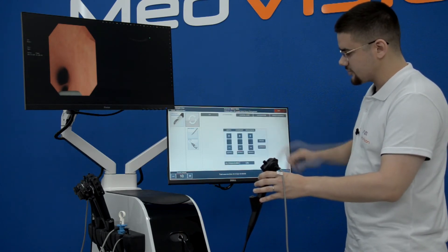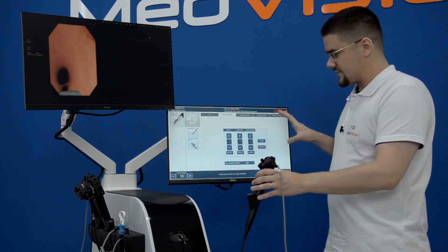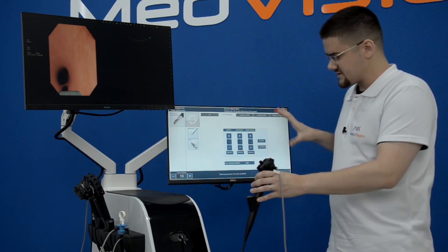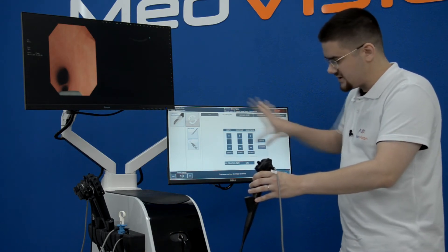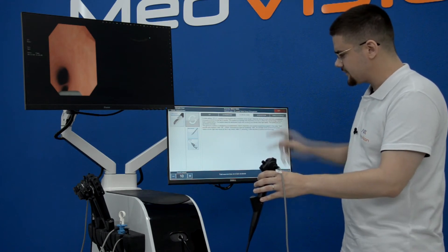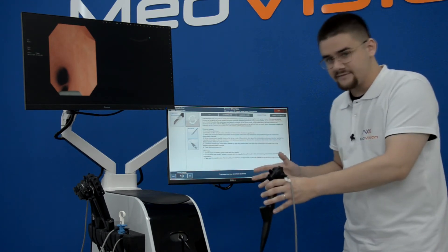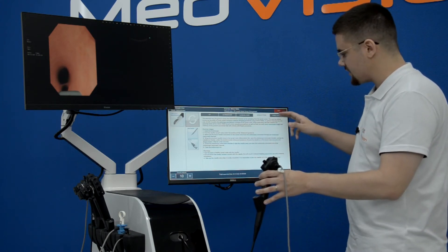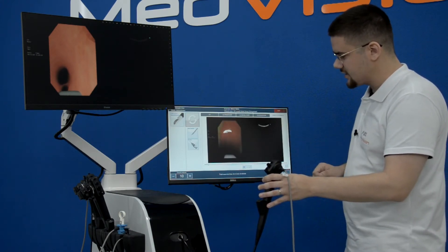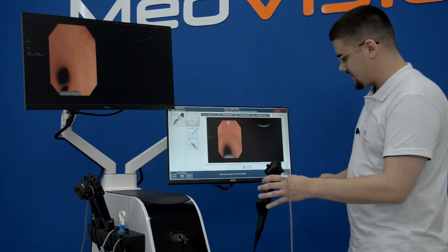I can switch to ultrasound controls. With most of our simulators, some of the virtual controls will be here on the touch screen. There is a clinical case description and a description of the module. Just like with LapVision or NGOVision, we have video tutorials, and you press here to see how this module should be performed.